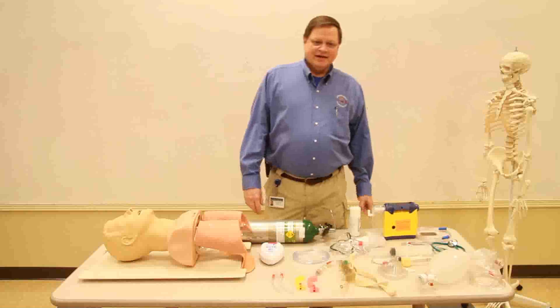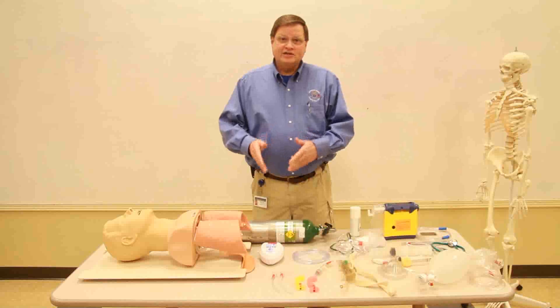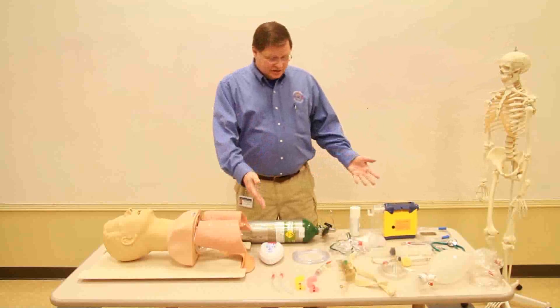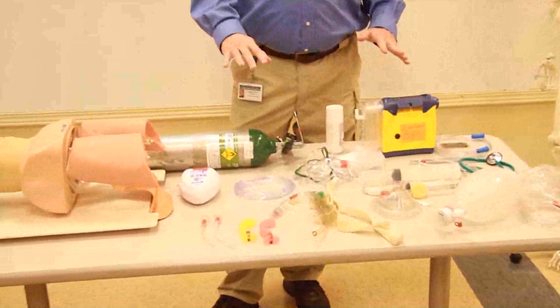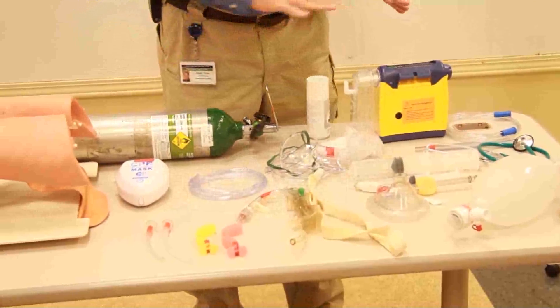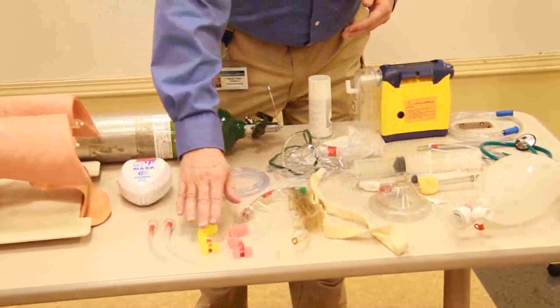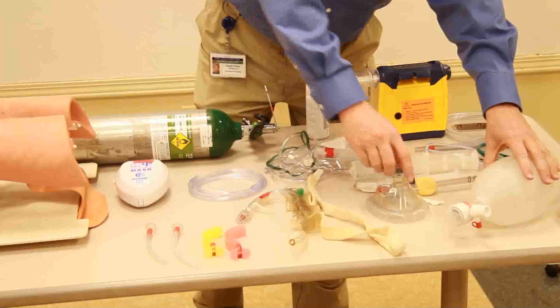Hi, my name is Randy White. I'll be demonstrating for you the oropharyngeal airway, the nasopharyngeal airway, the bag valve mask, and the ventilatory process. As we pan down here, we can see there are a lot of different things involved in airway and airway control. We're going to talk about each one in a different video, but right now we'll be doing the oropharyngeal airway, the nasopharyngeal airway, along with the bag valve mask device.